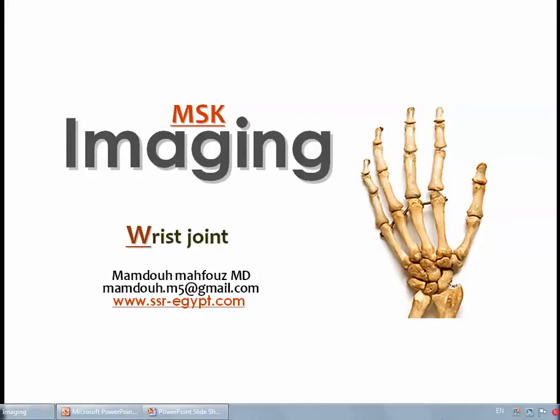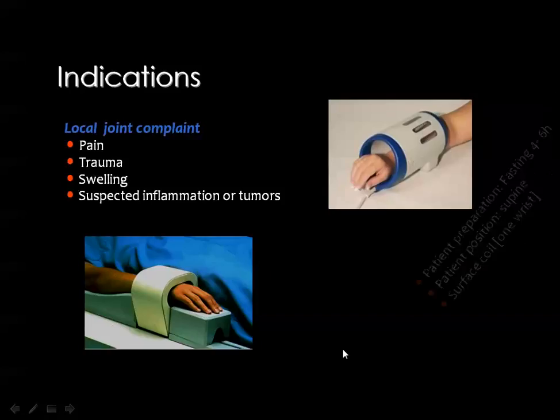Dear colleagues, in continuation of the musculoskeletal imaging series, we will start now to discuss the imaging of the wrist joint.